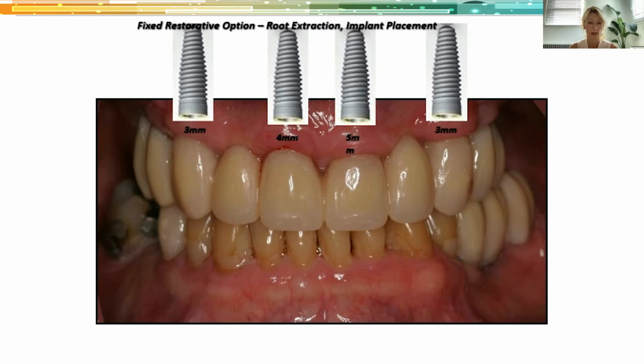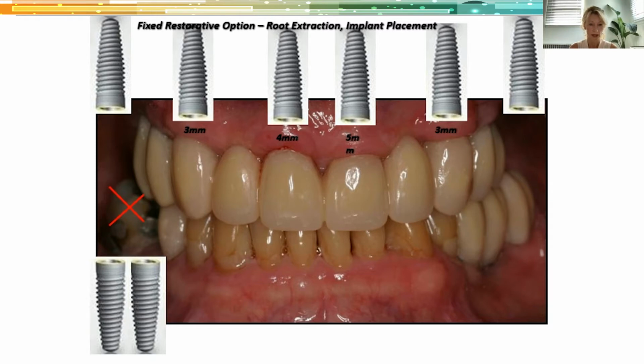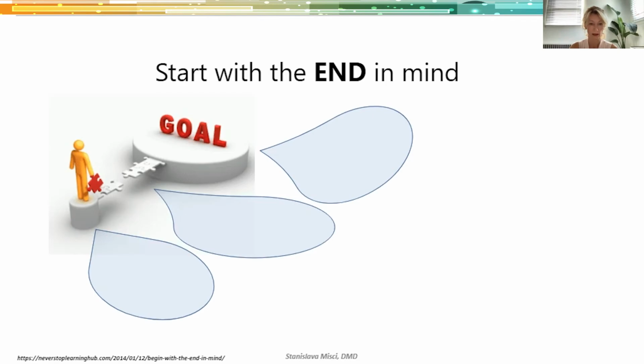And we can plan for a little bit of graft in the lateral region, and of course some implants posteriorly. So basically, by having this prototype, it gives us a lot of information for our implant placement. So again, the prototype is very important to have the next steps outlined and determined, so we can have a predictable final result.